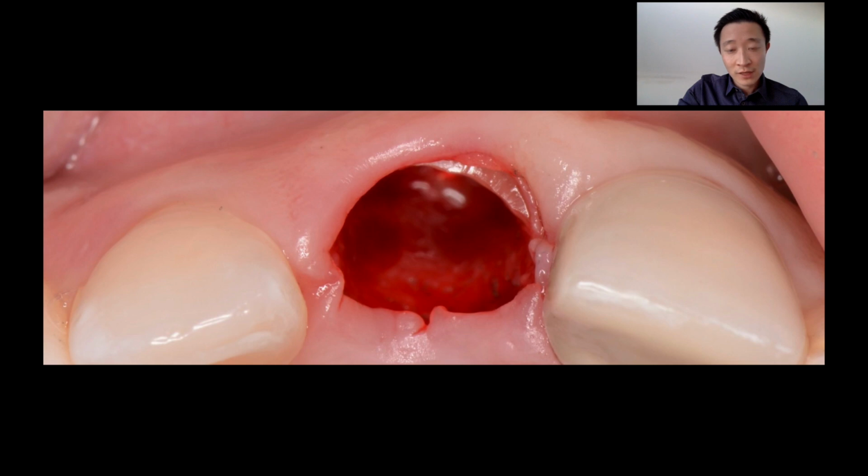So further preparation of the root ends in this configuration where we have a thin buccal root left. It's kind of a crescent shape, so we're taking into consideration that potentially the neighboring 2-1 may be lost in the future, and we're hoping that part of that root is going to help us keep that interproximal bone there.